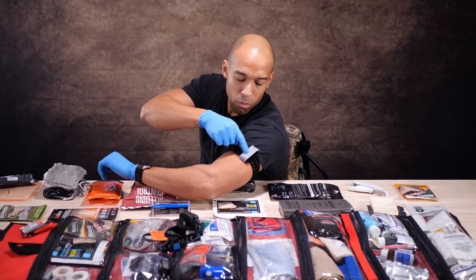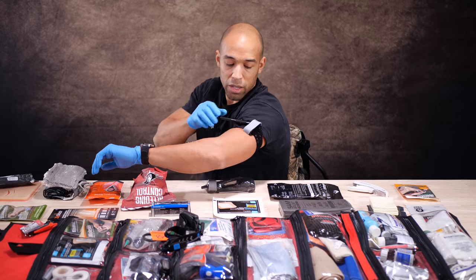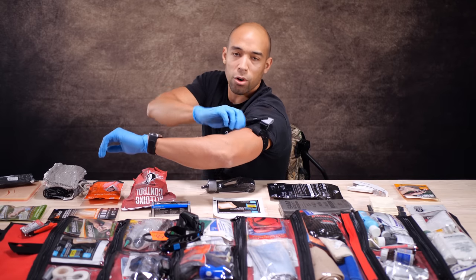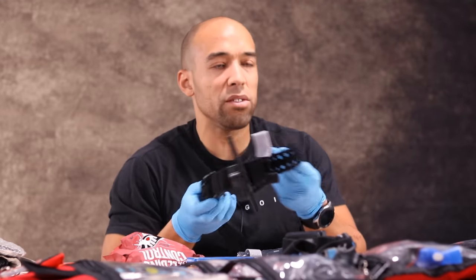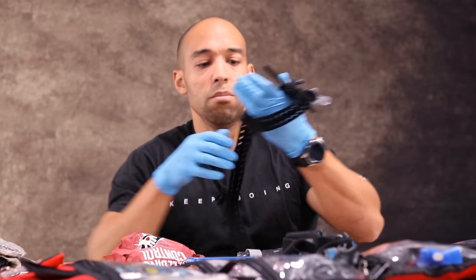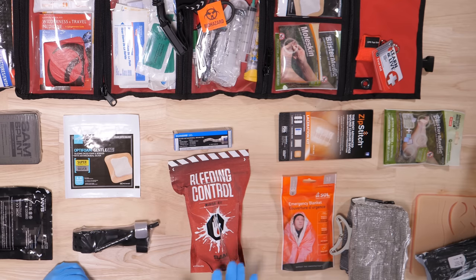Skinny Medic has a great demo of this. Then I can write the time on there so I know how long the tourniquet has been on. One warning about tourniquets: you can cause nerve damage. It is a little abrasive on the skin, but that's to keep it in place. Having the knowledge of when you should use a tourniquet is definitely going to be essential.